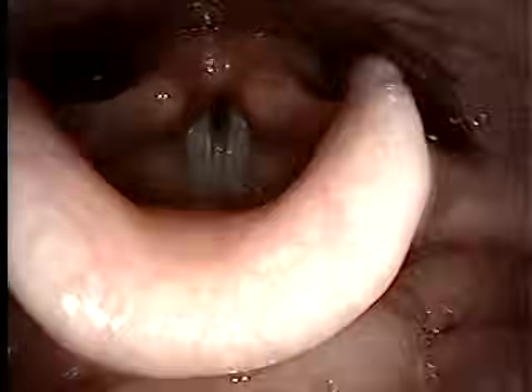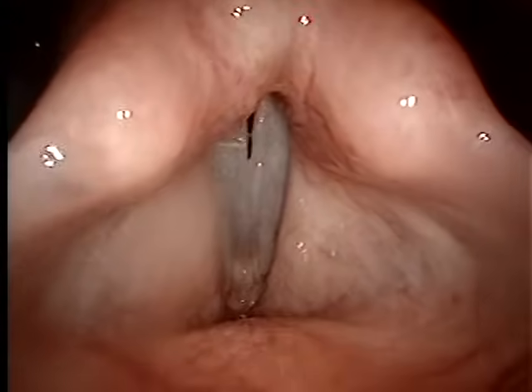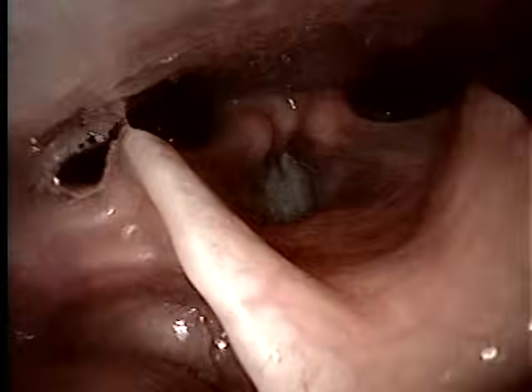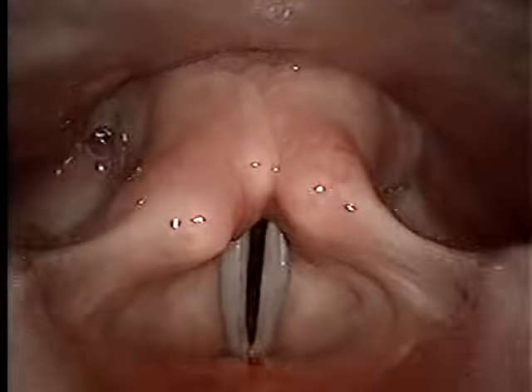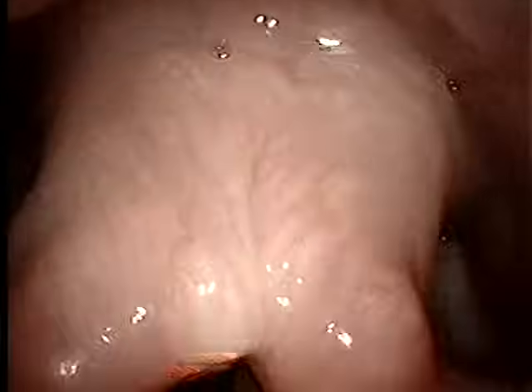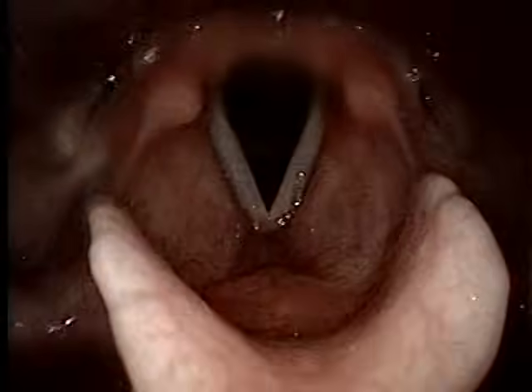That was weird. Yeah, it was having a hard time picking up tracking. A lot of people do warm-ups on ah, like it's easier. It doesn't seem to be a huge difference on this. Ah, ah, ah, ah. Really have to get down there to see them with that. I'll do it higher. Ah, ah, ah, ah.